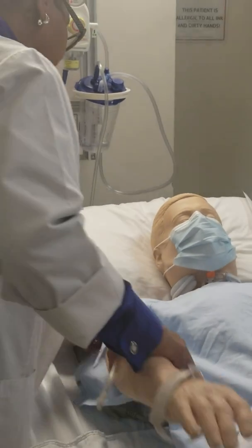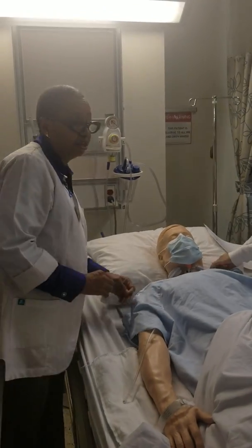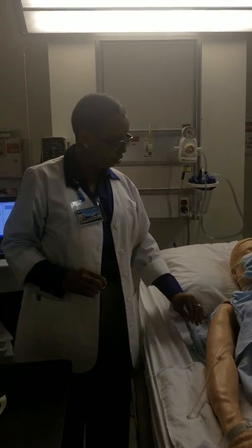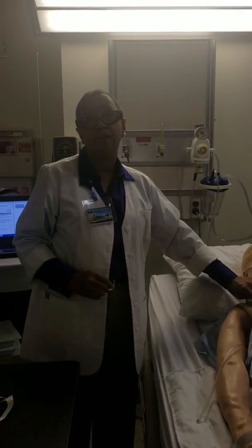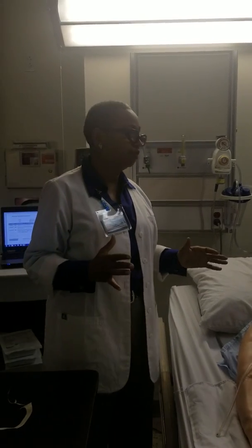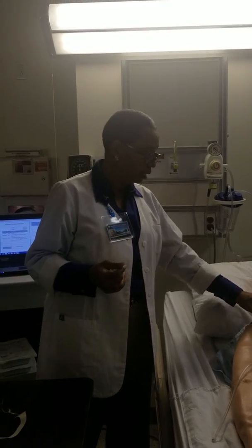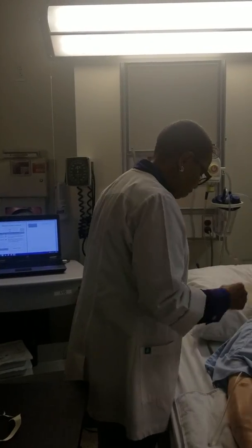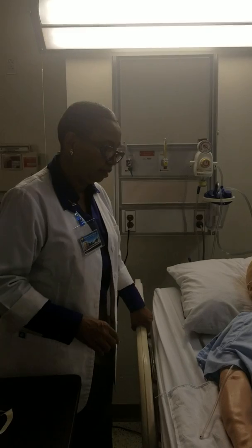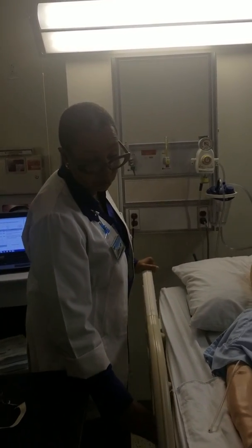So go ahead and reposition the patient. You got to do your documentation. What would your documentation say? Like I said, if you had to change your caps, I would have changed my caps before I even started. Most times if they're green, they'll tell you when to change them and how often to change them. After that you can lower his head, you can take his mask off, document the findings. Pretty much that's it. What are the questions?